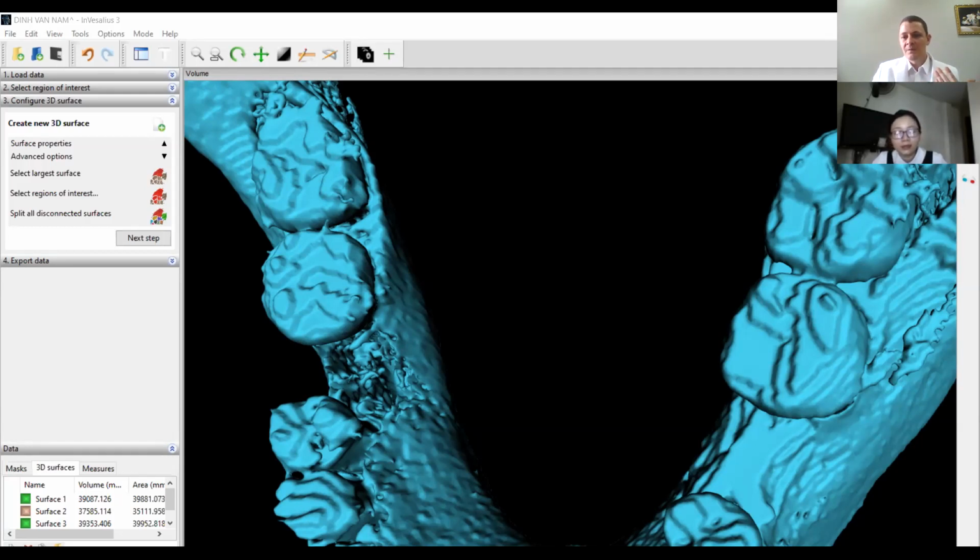I know what you are going to tell me. Oh, but if I tell the patient I have to extract a premolar, the patient will say no, because in Cambodia they don't want to extract. So you can show them this 3D file.